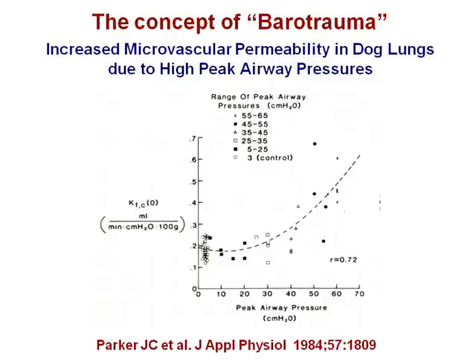So now I would like to start from the beginning, when we are dealing with monitoring the patient. We have a patient with acute lung injury, and the patient is intubated. So what happened in that situation?